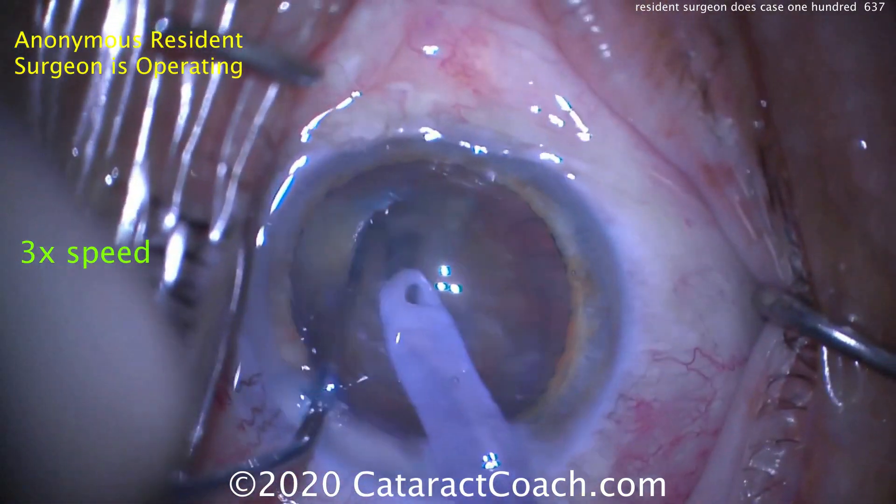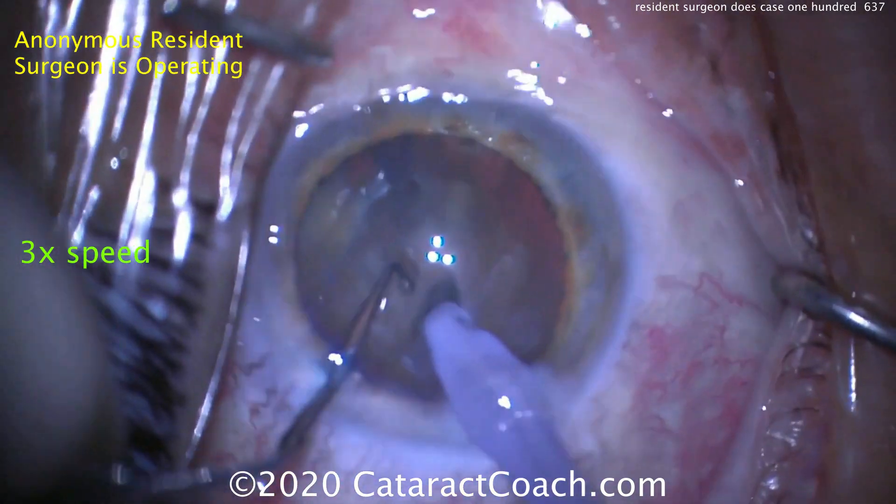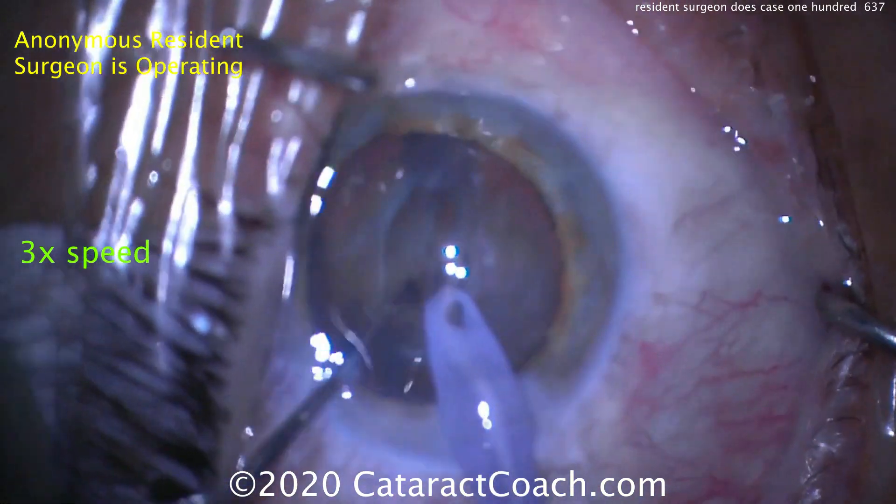Now the second instrument is going in the groove. Let's see — does this crack or separate out into halves? Looks pretty good. And good propagation of the crack. I like it.